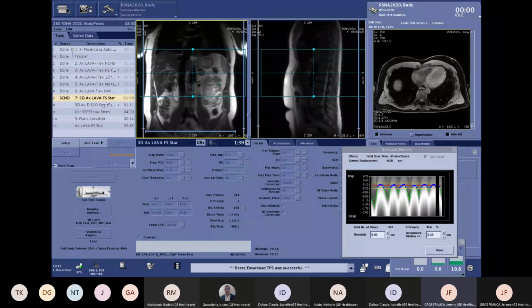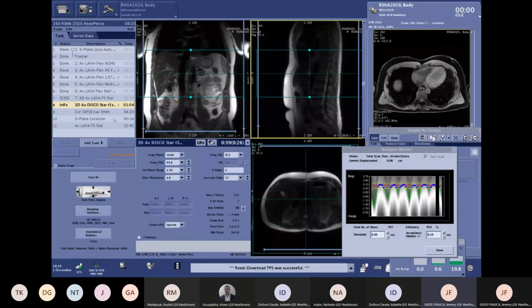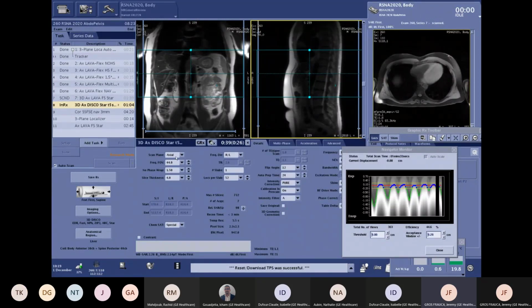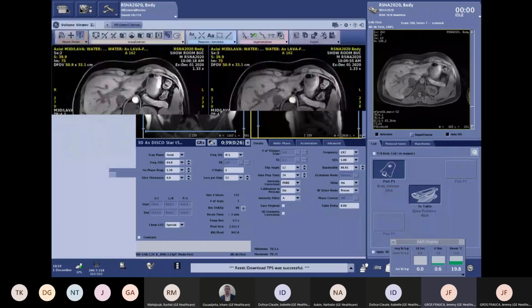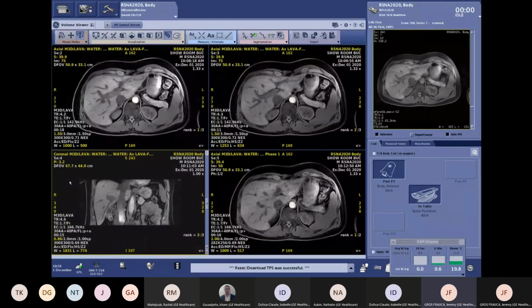I think we can now position the last free breathing technique. So here we are using. Maybe, Jeremy, yes, you can just display the reformats of the high resolution one. Okay, how it fits in other views. Thank you. Let's compare with this one.